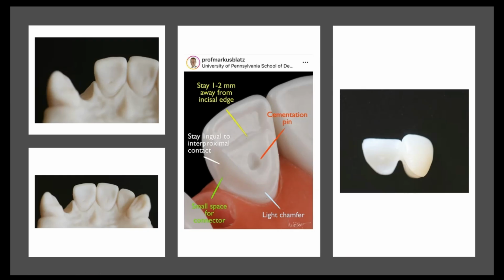If you're doing a keyhole with ceramics, you're going to have a failure more times than not. Guess what you can put this in with? You can put it in with Panavia SA Cement Universal and Universal Bond Quick. You prepare the wing the same exact way as what I just showed you with the crown. You prepare the tooth the same exact way as I showed you on number 12 just a minute ago.